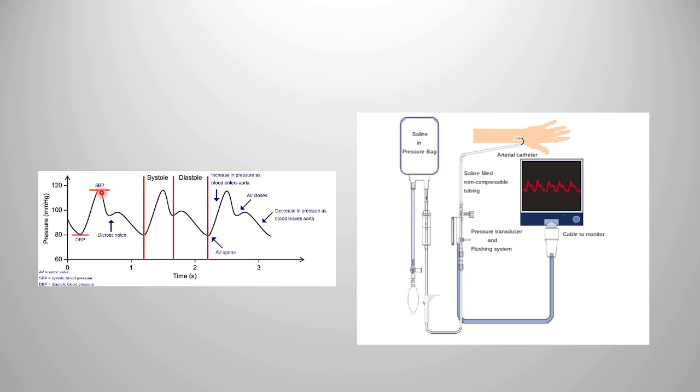We get a systolic upstroke, then there is a fall in the blood pressure, then the aortic compliance, it is called the forward compression, and the other area of the dicrotic notch is called the backward compression, which is because of the compliance of the arterial system. The dicrotic notch gives us a rough estimate of the closure of the aortic valve. And the area under this arterial blood pressure curve usually gives the cardiac output. So various monitors that use pulse contour analysis calculate cardiac output based on the area under this curve.